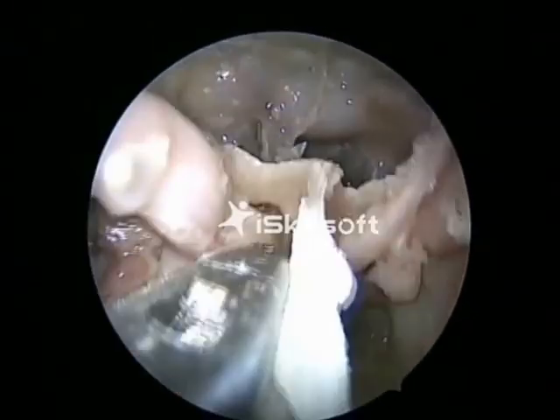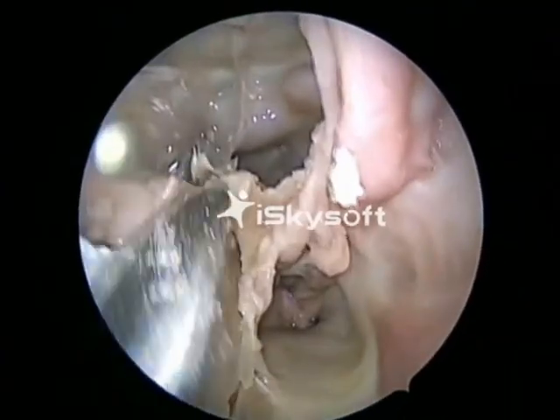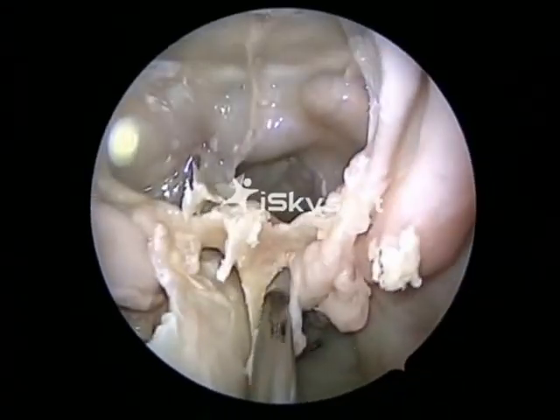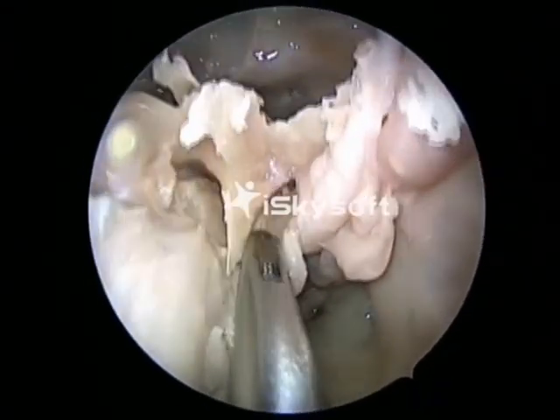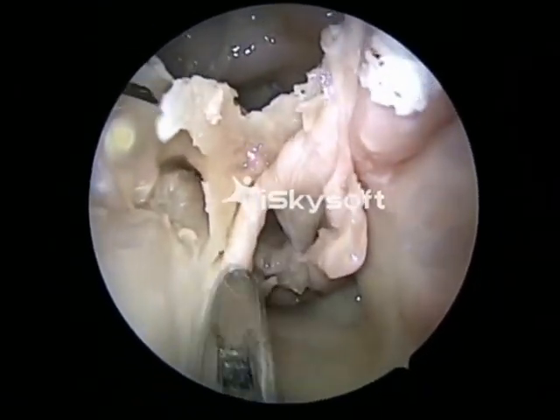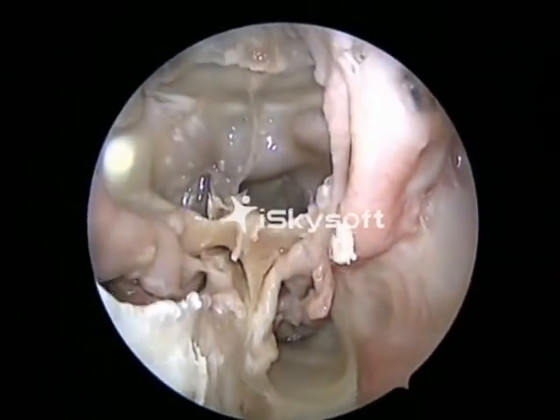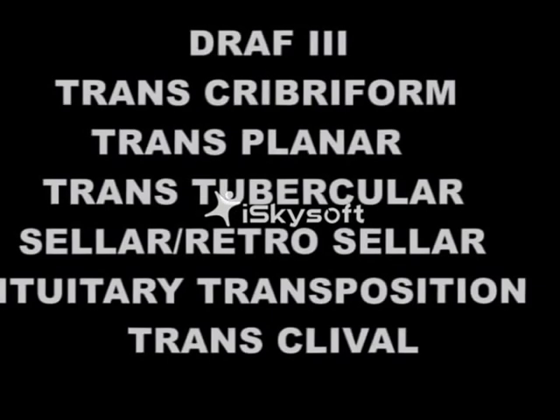The next step, we expose the sphenoid keel, we make 2 shoulder osteotomies and remove the floor of the sphenoid sinus. We believe that when we are operating on the pituitary, we should have 2 suction tip exposure below the sellar level. This completes the nasal stage of dissection. We go to part 2.